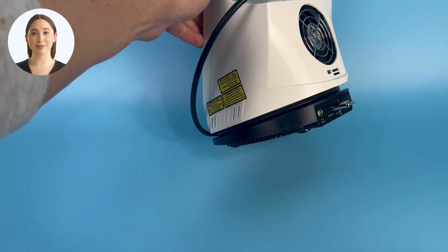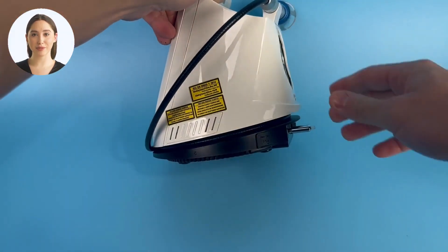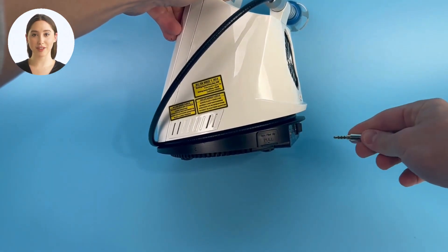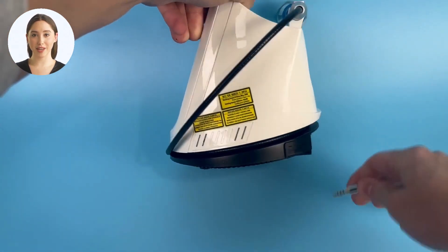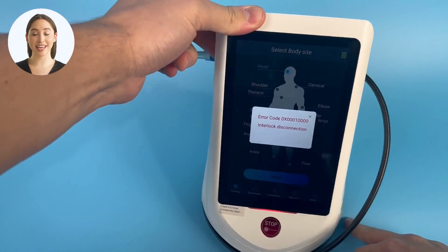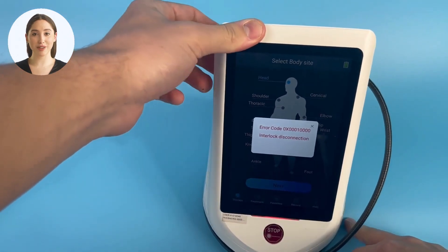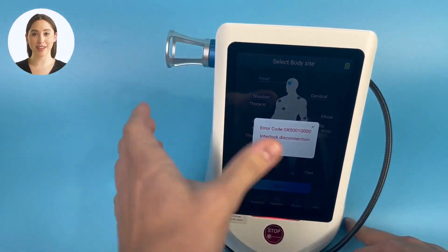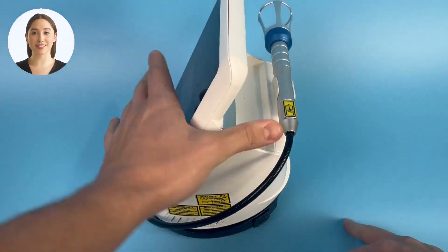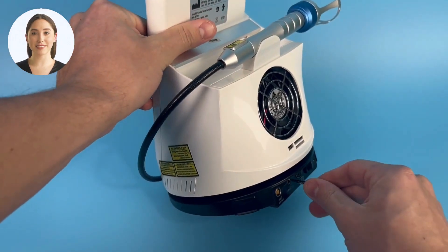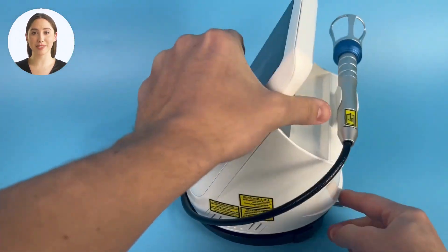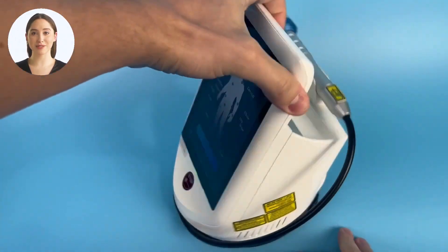The last thing we will cover in today's video is the interlock feature. Not all EVOs require an interlock, but those that do will not operate without it. The interlock is a small attachment piece found in your EVO case that plugs into the back of the device. To fix the error on the screen, simply plug in the interlock and begin treatment.